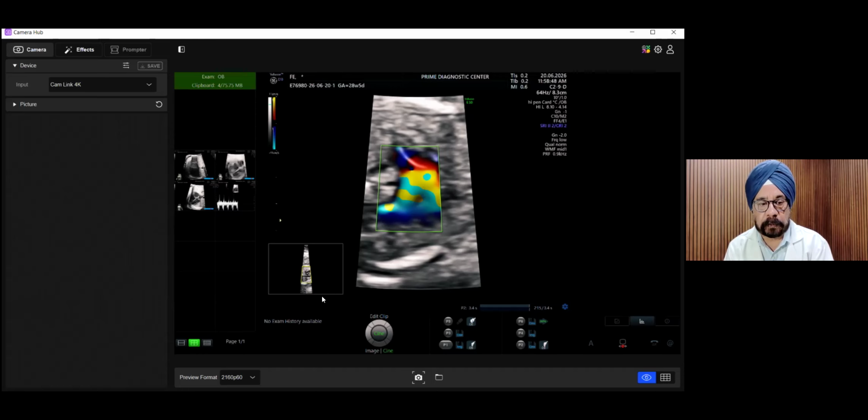So I suggested doing a sagittal view of the aorta to look for tortuosity, because arterial tortuosity is a particular genetic syndrome which should be looked for. So there we looked for it because something was abnormal, but I would add at least the bicaval view in the extended views. Thank you, sir.